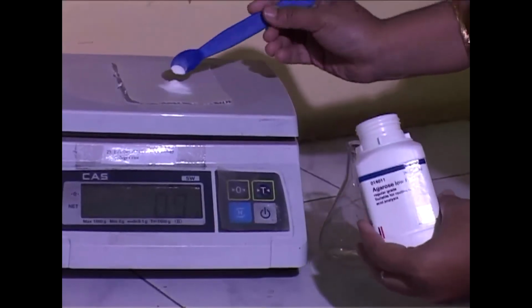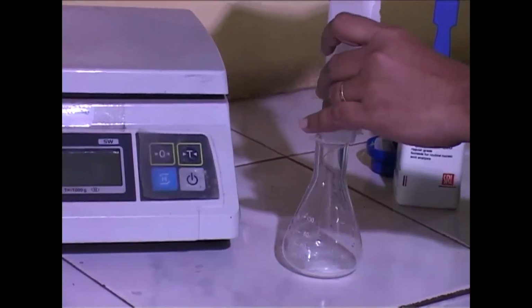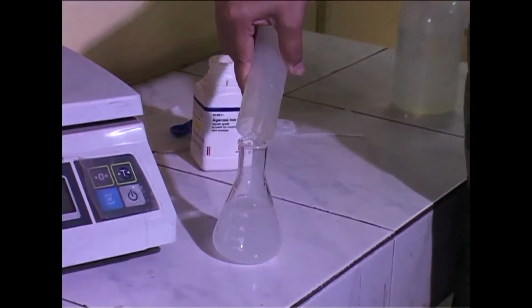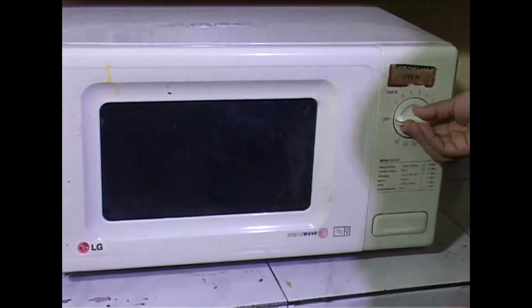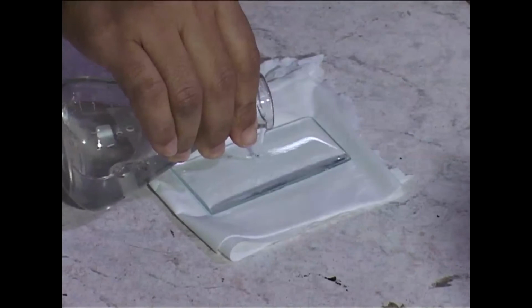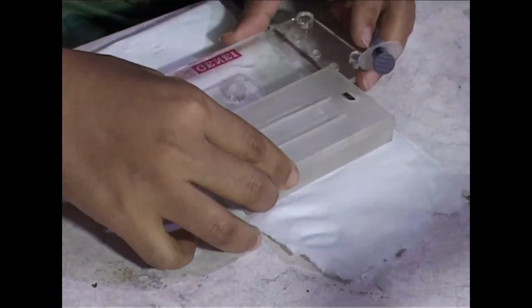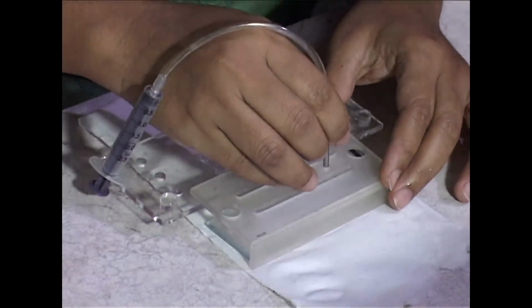Now, for doing immunoelectrophoresis, we need to prepare 1.5% agarose gel. So, you weigh the exact amount of agarose, you take it in water and then melt it. Then you pour the agarose solution on a glass slide, allow it to solidify, and then you punch a well on either side of the glass slide.